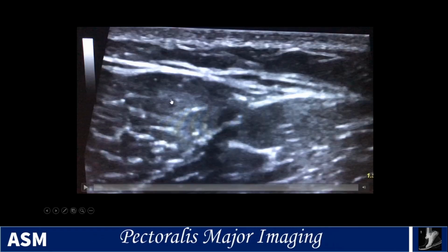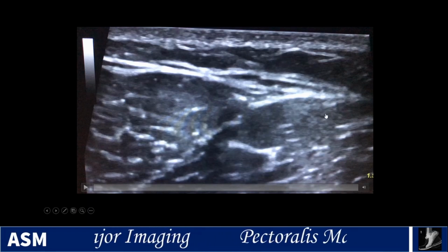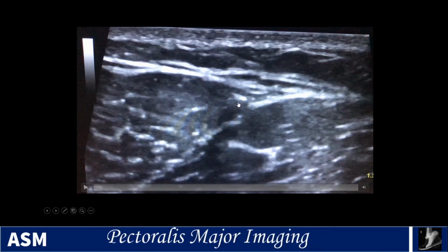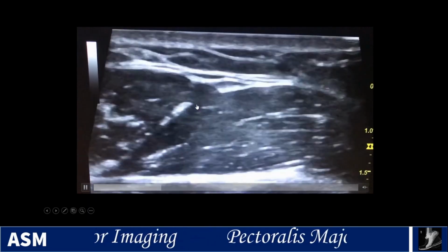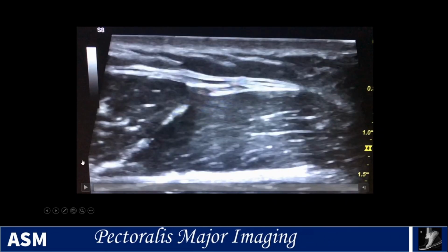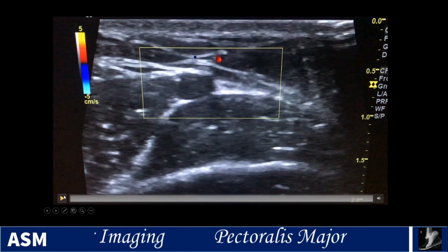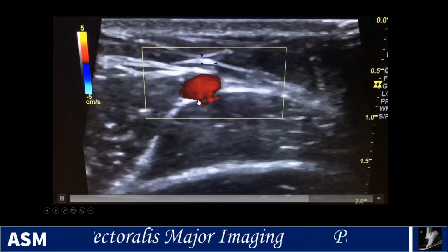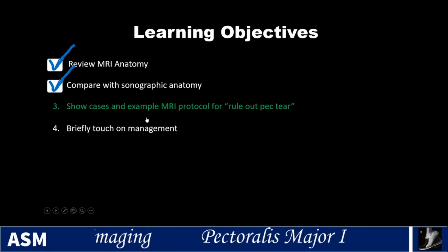You can use the ultrasound to confirm that though, and so this is a little bit blurry, I apologize, but here's your anterior deltoid and your pec here, and there's the vein, and if you watch, we're going to scroll through in a second and see this vein collapse with probe pressure and reappear. So there's a vein, you squeeze it and it goes down with this vein. And if you don't believe that image, we can go, and this is with augmentation. Here's the vein here, and when I squeeze and contract muscles in my forearm, you can see that there is flow in that vein right there. So this is augmentation, just showing this is the cephalic vein in that deltopectoral groove.